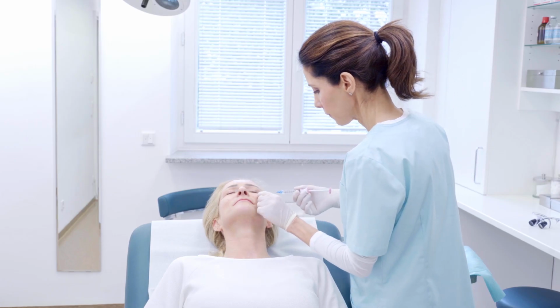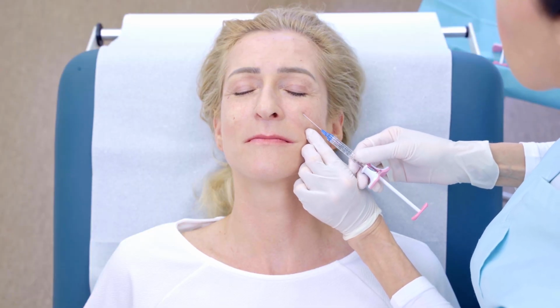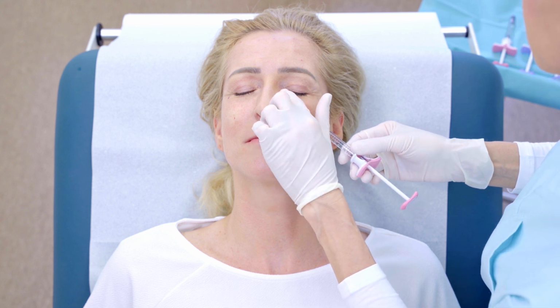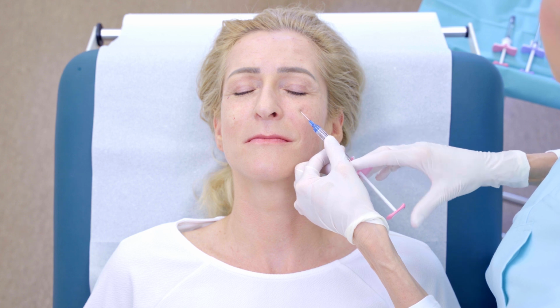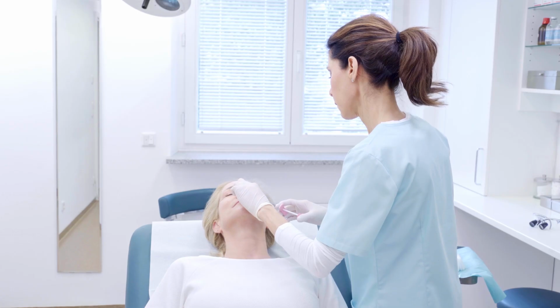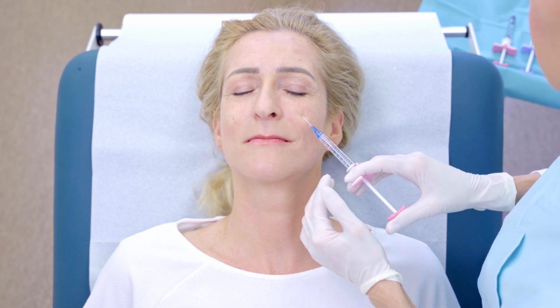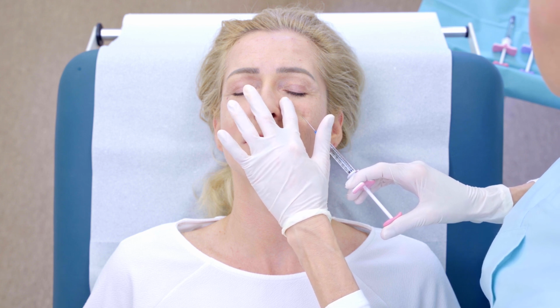I used so-called blunt needles for that. These are atraumatic, which means they are easy on the tissue and non-damaging while delivering the filler to where it needs to be placed. Unlike sharp needles, these ones have a blunt tip, protecting the many sensitive blood vessels and nerves underneath. And they are also longer than sharp needles. The extra length allows me to work throughout extended areas of tissue.